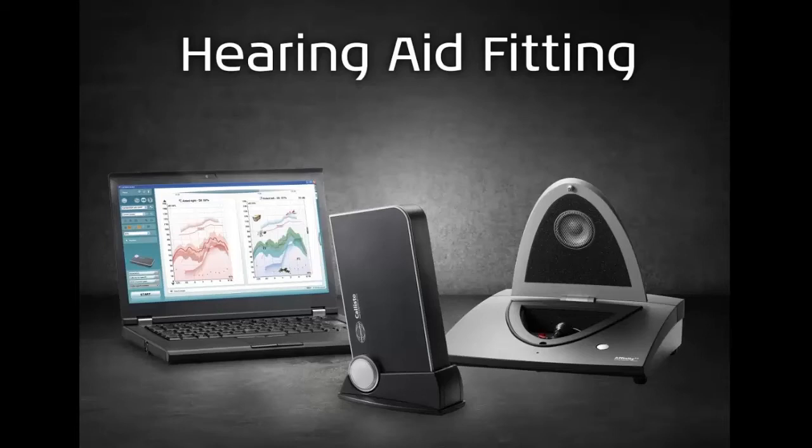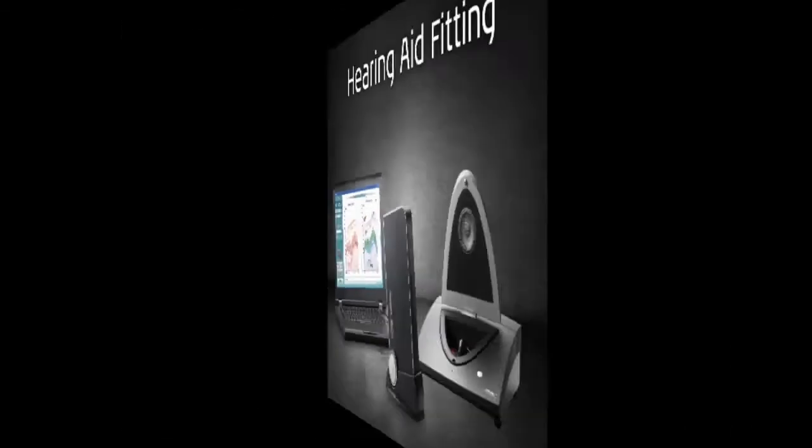Welcome to this video which demonstrates how to perform pure tone audiometry on the Affinity, Equinox and Callisto.